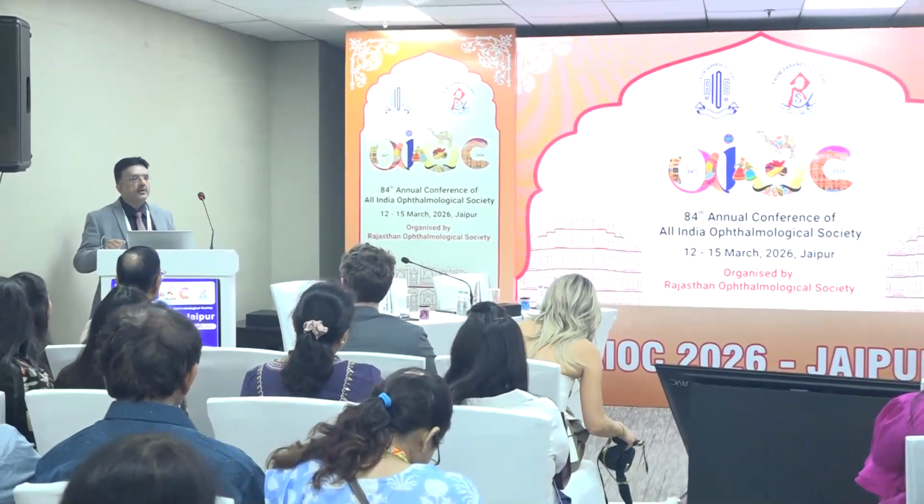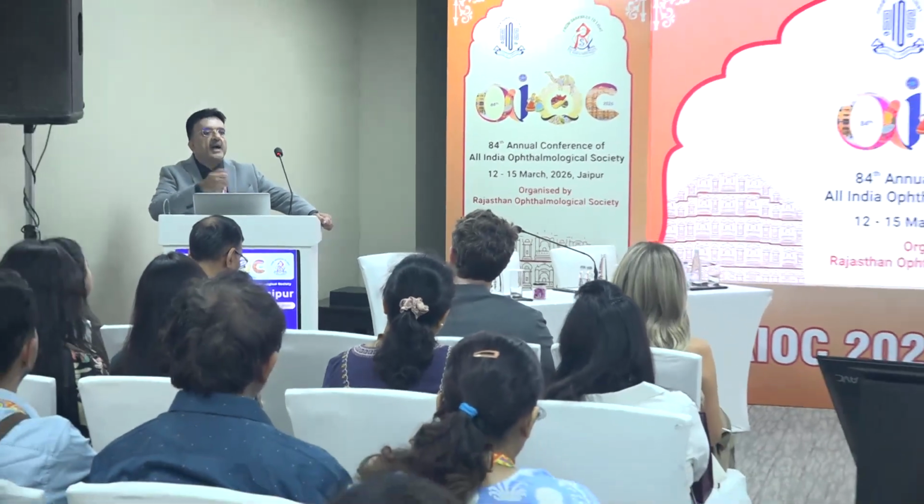Beautiful technique, beautiful surgery on that. Thank you. When you have very myopic eyes, do you have a preference if you're going to do a primary piggyback IOL? That depends on the power you've calculated. This IOL power was -3, so it's available with Alcon. I think they go down to -6. I haven't operated any eye which had a power more than that, but definitely, like you say, a piggyback can be done. It's more common in hypermetropes. But in myopes, I have not done it. But yes, you have a valid point.